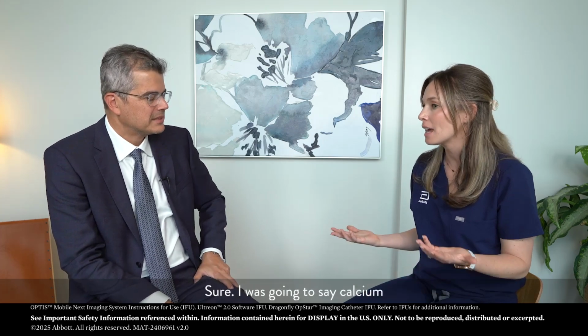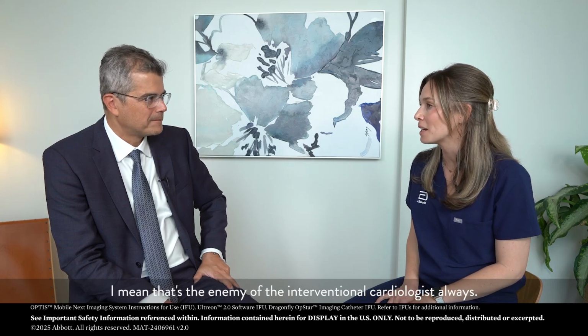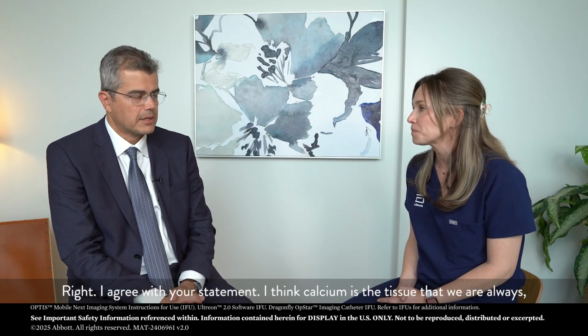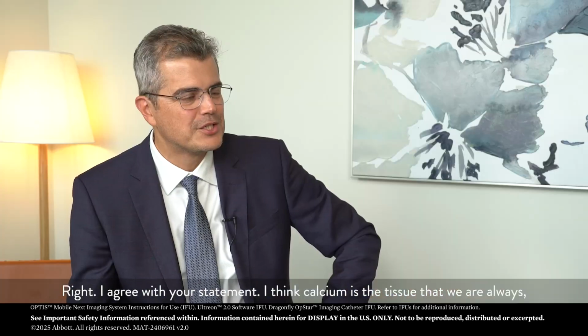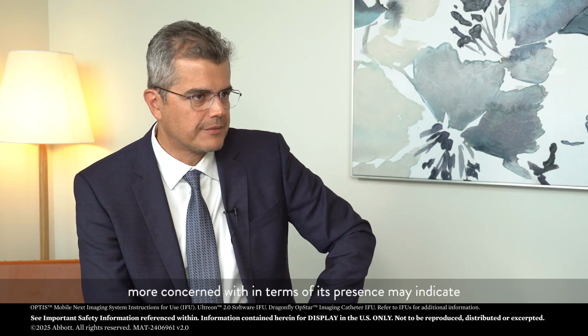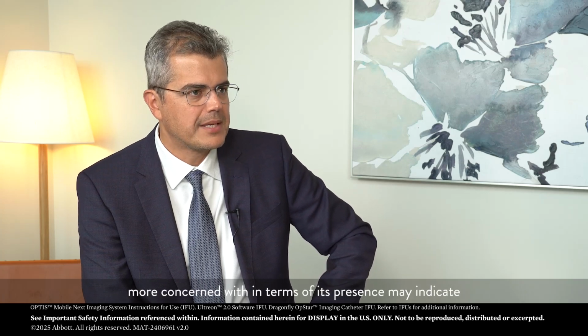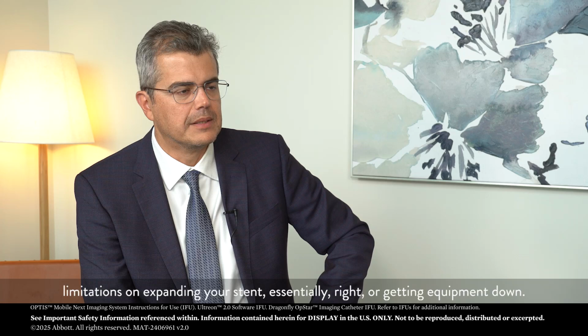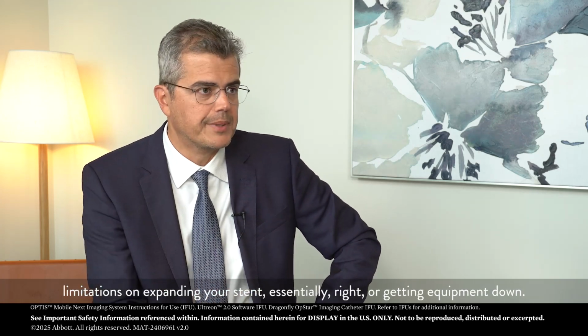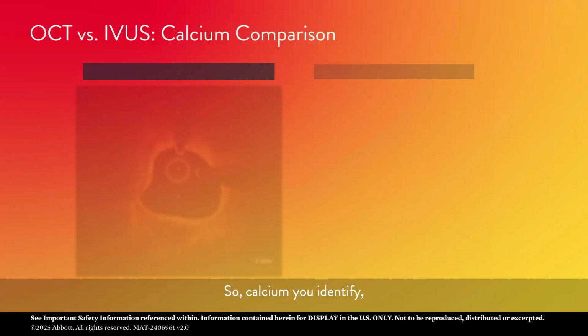Sure. I was going to say calcium, I mean, that's the enemy of the interventional cardiologist always. So with OCT and calcium, what do you look for and how do you assess calcium and how does the software help you assess calcium? Right. I agree with your statement. I think calcium is tissue that we are always more concerned with in terms of its presence might indicate limitations on expanding your stent, essentially, right? Or getting equipment down.